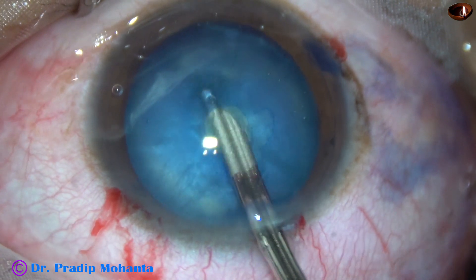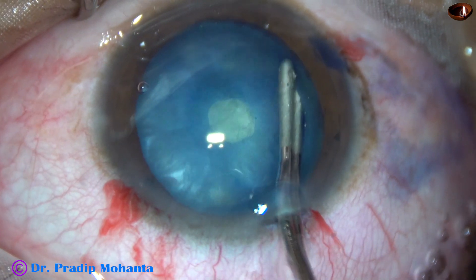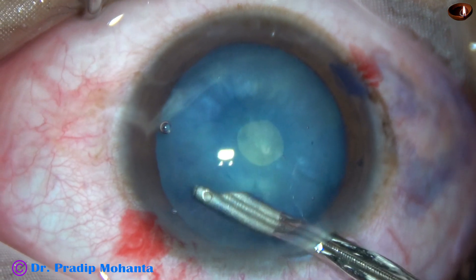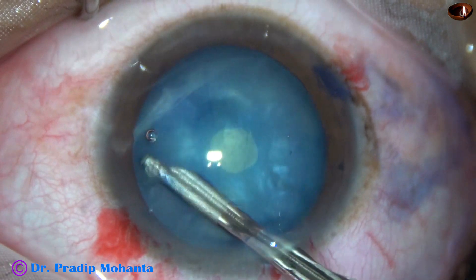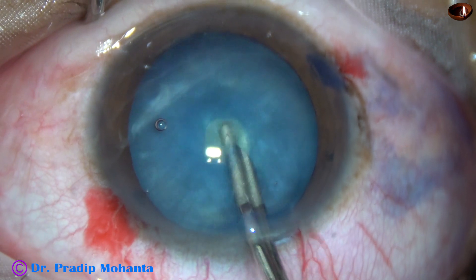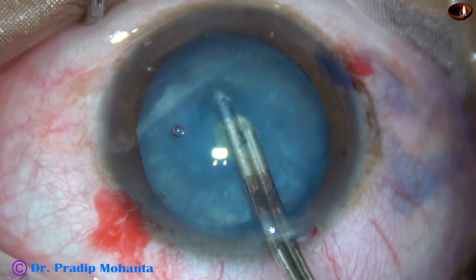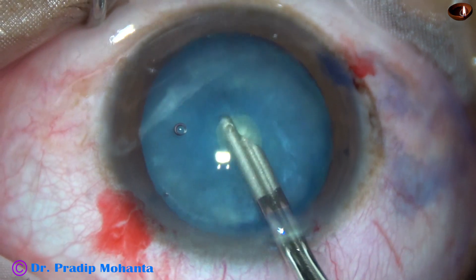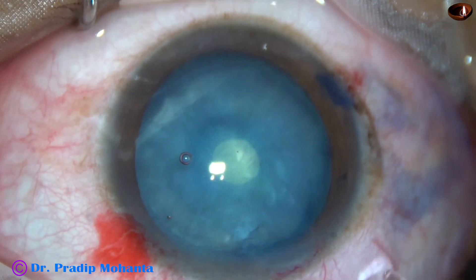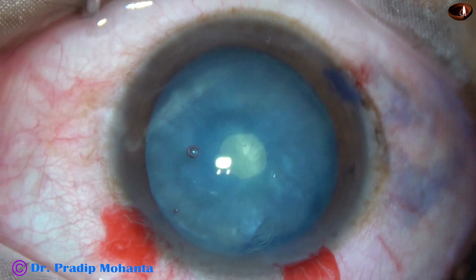And if I try to go to the periphery, it may run out. And now I am squeezing the cortical matter, bringing it to the central area and aspirating. Everything is going as planned. But observe the mistake here — I have aspirated cortex from all around, but the sub-incisional cortex is not aspirated. The capsule is elevated at that area.